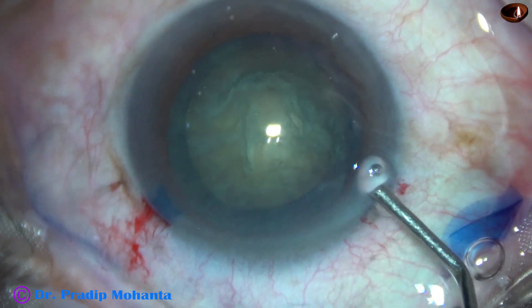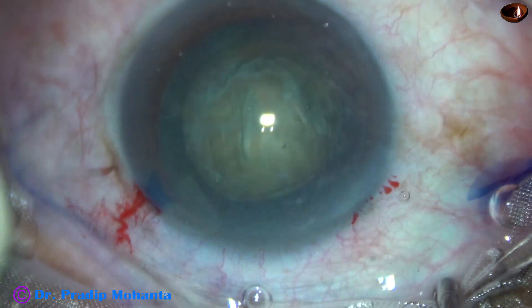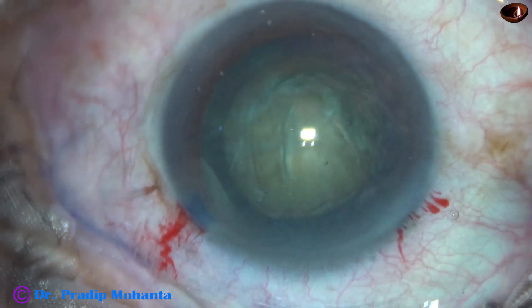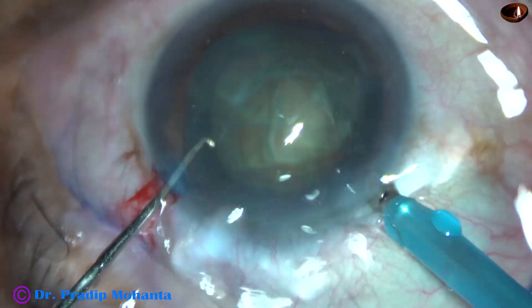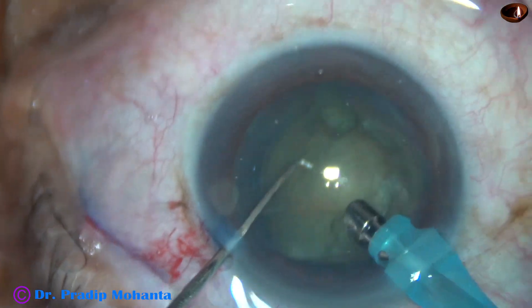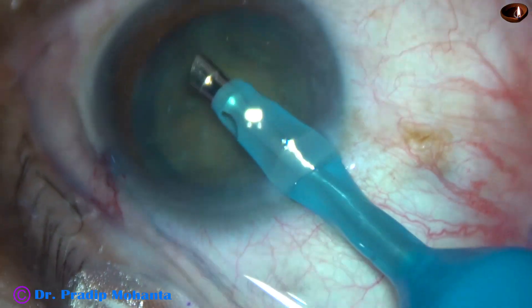Some visco is injected into the anterior chamber, and then the tip of the phaco needle is introduced into the anterior chamber. This is Ozil torsional phacoemulsification. The tip goes into the substance of the nucleus. Let us see the direct chop technique in this case.